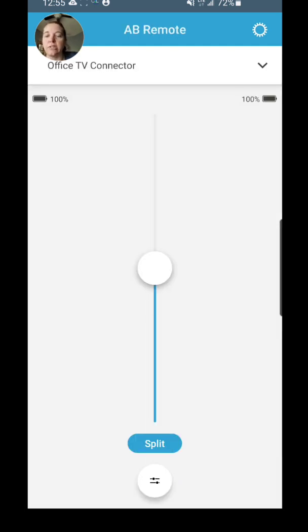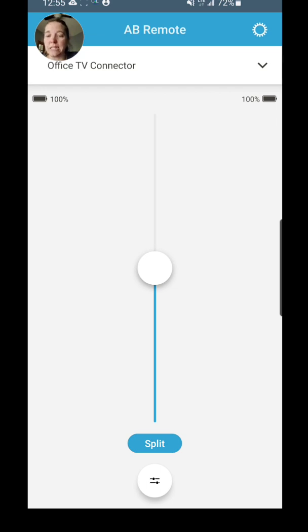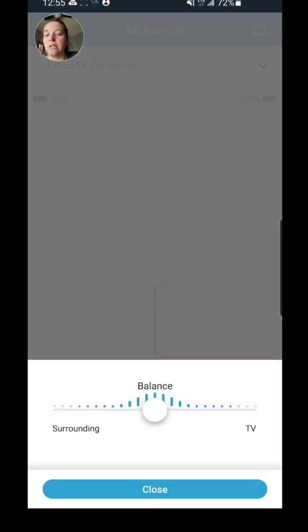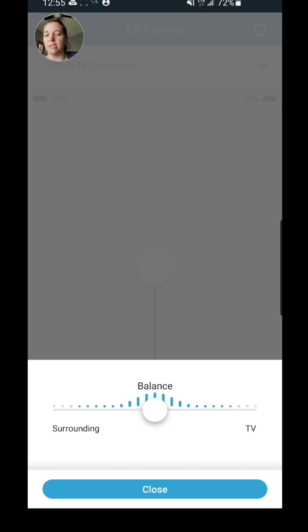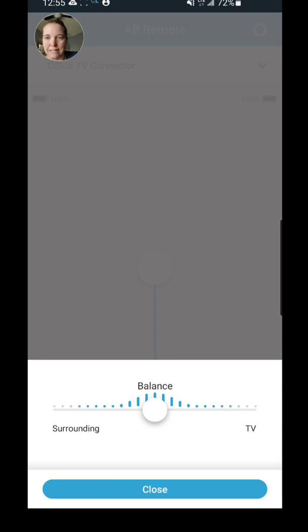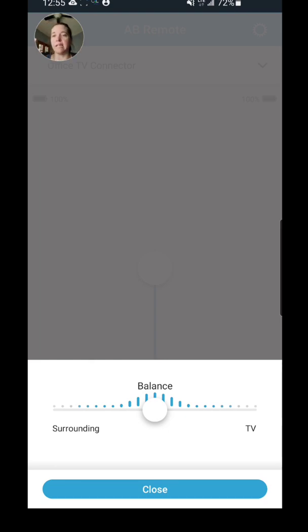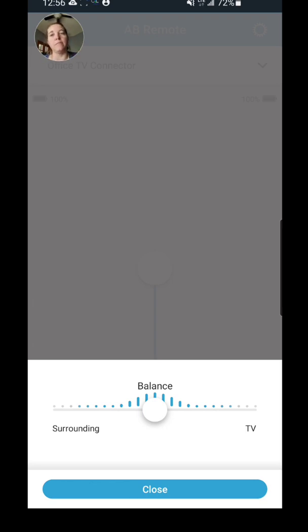You get another option that pops up here. So at the bottom, you'll see just below the split, there's another little thing that pops up. This allows you to control your balance, your environmental balance between what is being streamed through the device, whether it's a TV Connector, Bluetooth, Partner Mic, Roger, etc. You can adjust the balance of your environmental sounds and the streaming signal.